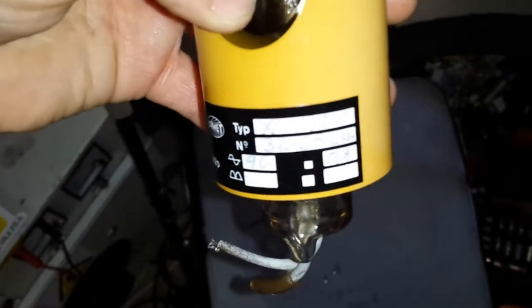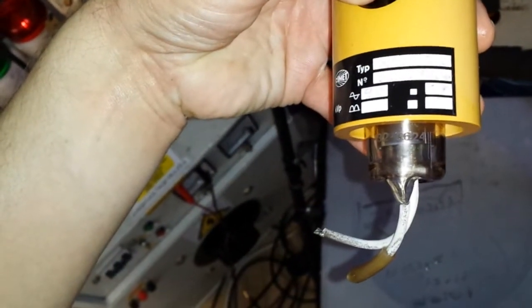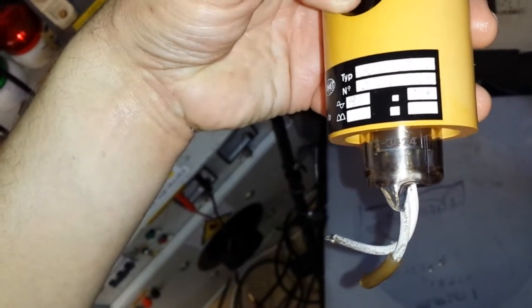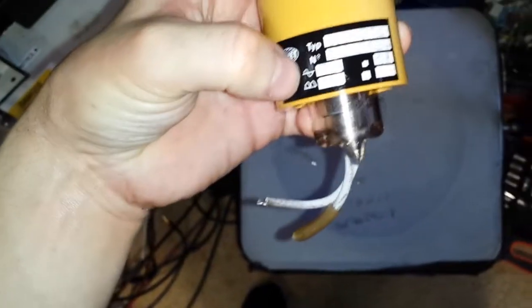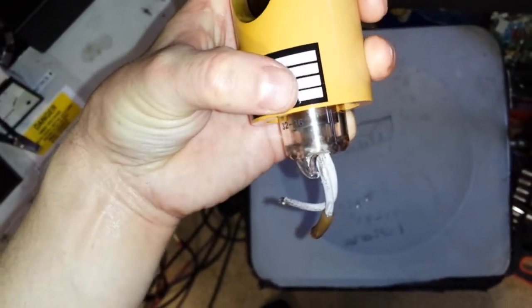valve, or tube, or whatever you want to call it. I'm just trying to focus on that number that it says there, XL90C. That's the type, and the number is 32-3624. And of course, that sign just there means that it's 90 kV, and the 0.8 is the milliamps. I'll put that over here on this cloth, because it's still bloody wet. I don't believe it.